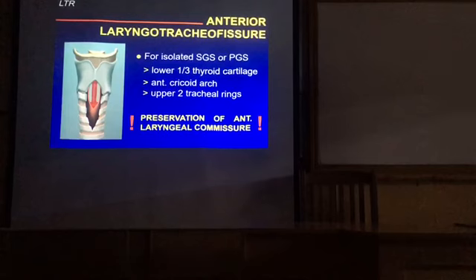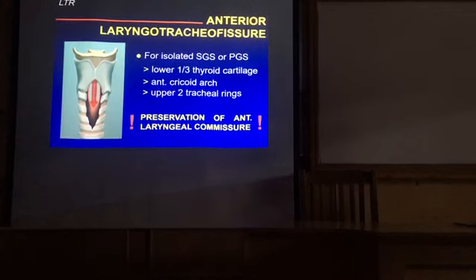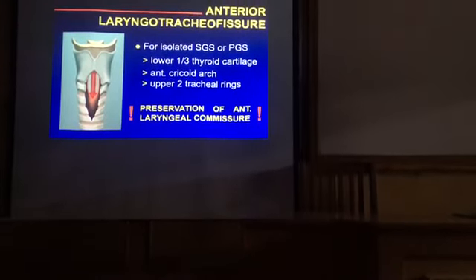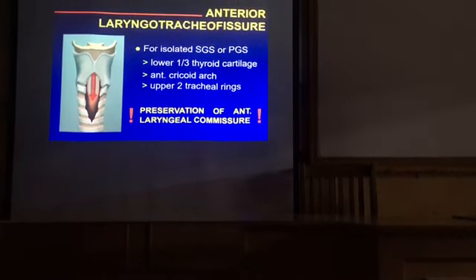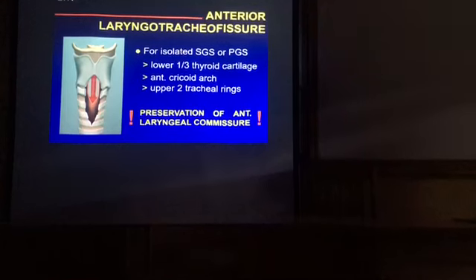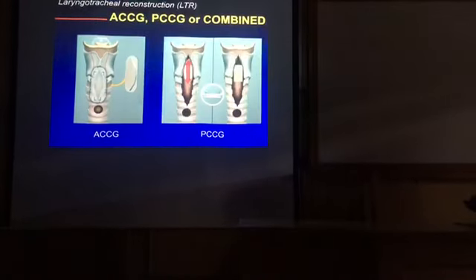So it's destabilizing the larynx very much, so you have to be careful, because in your reconstruction, if you are not suturing the posterior graft very well, then your larynx is going to waggle like this, and if you don't have a good stent to stabilize your reconstruction, then you may have some deformity. This is why in the failed surgery that you see sometimes, you see overlapping of the arytenoid, because the posterior graft has been tilted and has not stayed well in place.